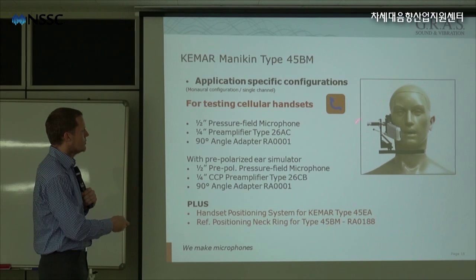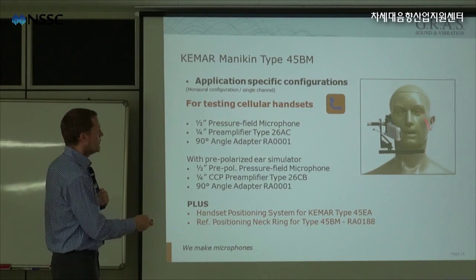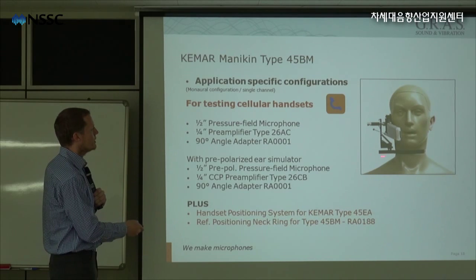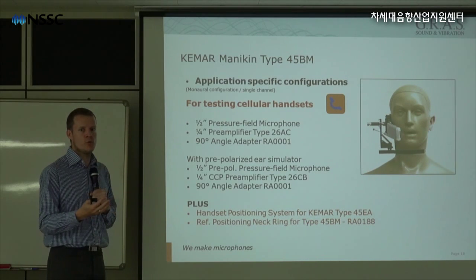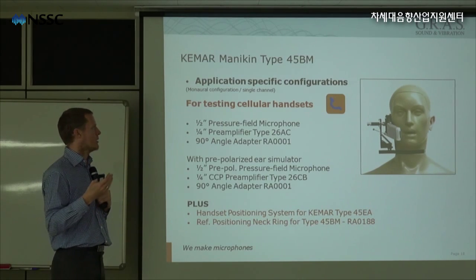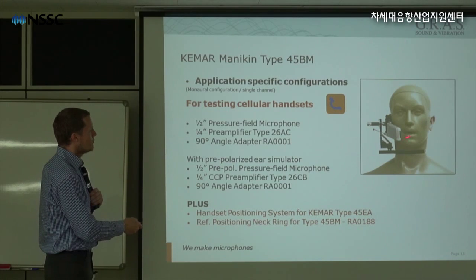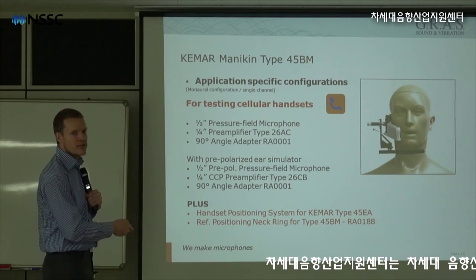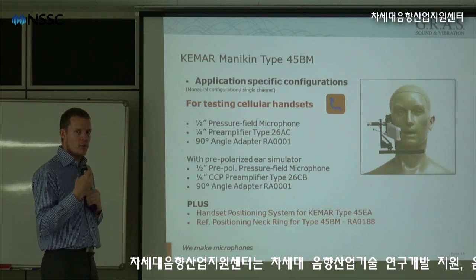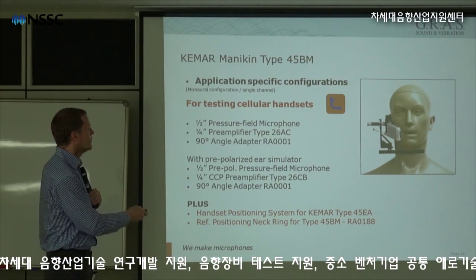The advantage with the KEMAR and the telephone test is that when you have a human mannequin, which is very similar to the human, it actually looks like a human, you will also get a performance like a human. So the reflections from the cheek, the nose, the lips, the entire face of the KEMAR are very similar to the reflections in a human being.